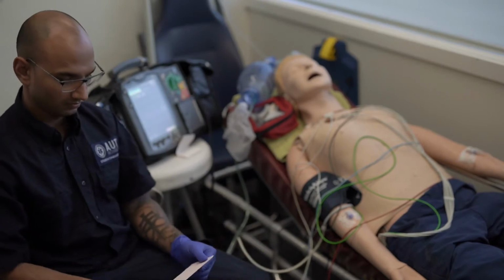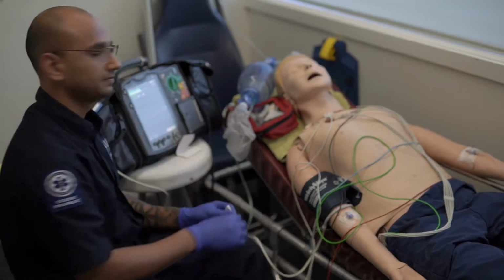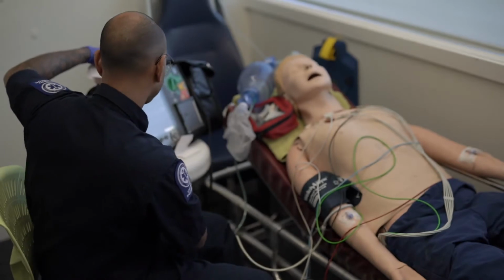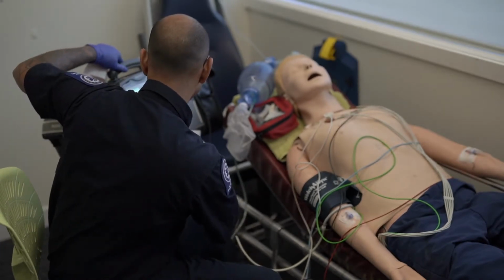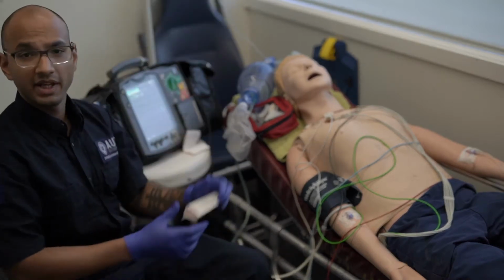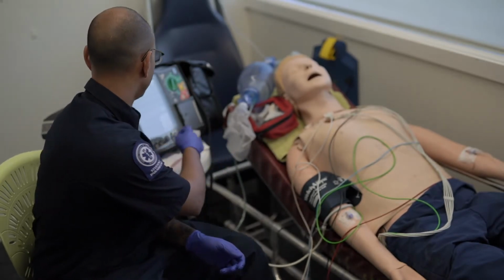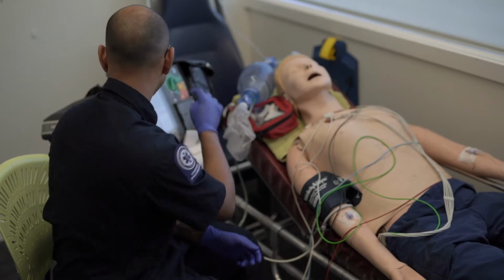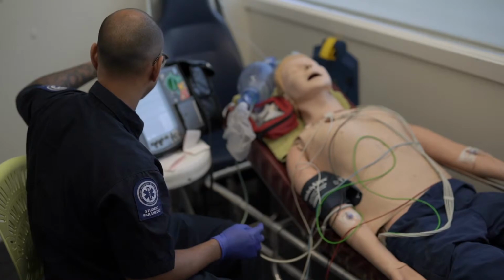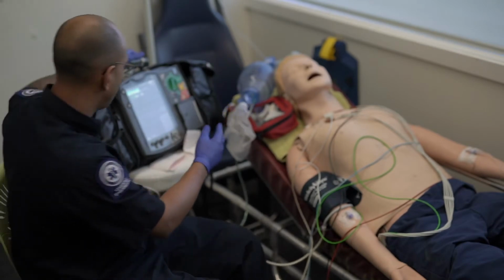Ensure the defibrillator is in manual mode. Our defibrillator is in manual mode. Select a lead with a visible R wave and ensure that artifact is minimized. Selecting a lead with visible R waves and artifact appears to be minimized. Select synchronized mode. Selecting synchronized mode. Confirm there is a detection symbol above every QRS complex. There appears to be a detection symbol above every QRS complex.